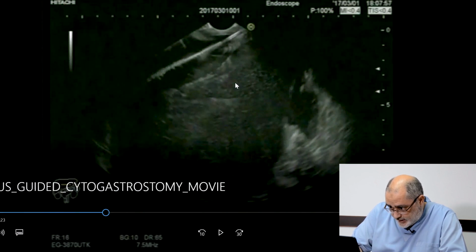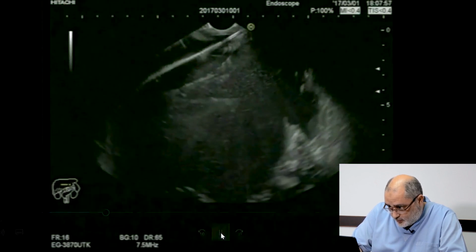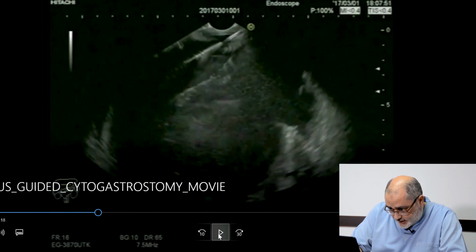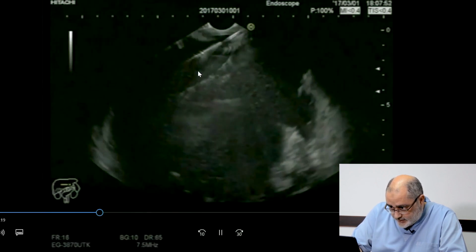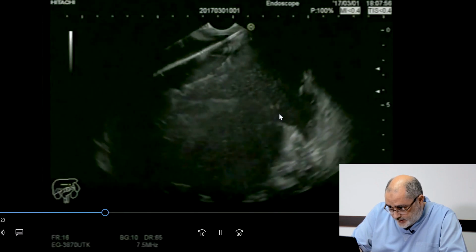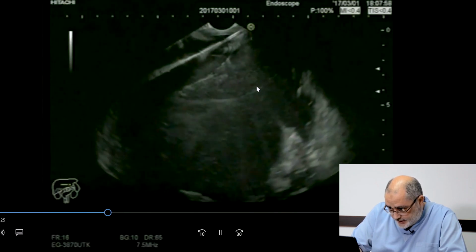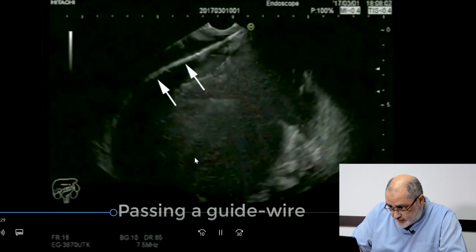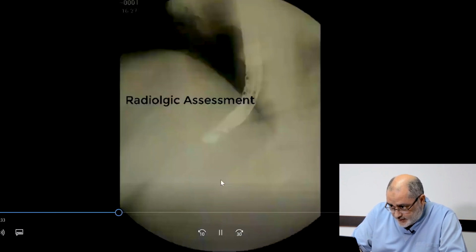It's coming here and we'll do a loop or a coil. Yes, it goes like that here, and we can observe it again. Now, here this is the wire, going like that. So we have 1.5 coils or 2 coils of the wire. So it is a suitable place, and then the wire inside.